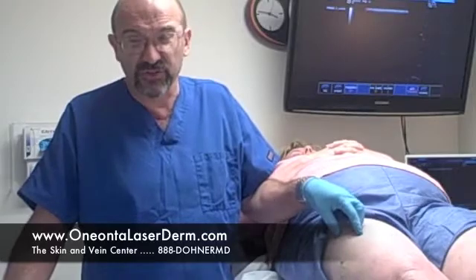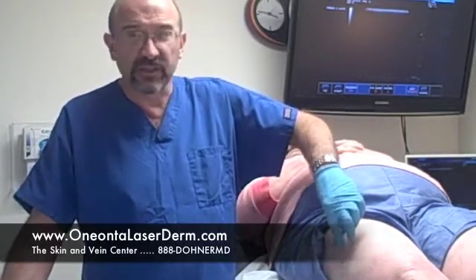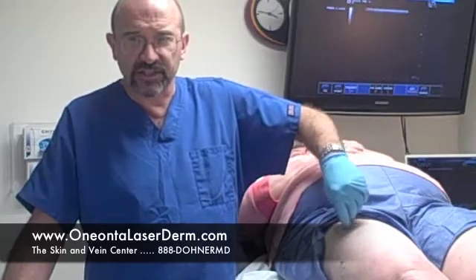In today's case, we'll be doing this on this young lady — her veins hurt, and we'll be injecting them. We'll be doing two different forms of sclerotherapy. The first is called ultrasound-guided sclerotherapy, in which we use our ultrasound machine to help us find the vein under the surface which is feeding these veins, and we'll use a longer needle to go into the vein, inject it, and seal it shut. The second way is called surface sclerotherapy, in which we inject veins on the surface with medication to seal them shut.